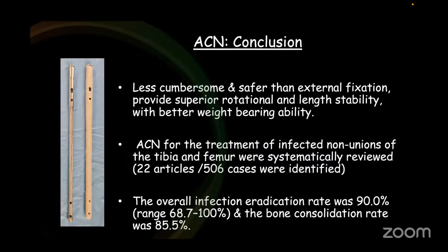Antibiotic coated nails for the treatment of infected non-unions of tibia and femur were systematically reviewed. 22 articles, 506 cases were identified, and the overall infection eradication was almost 90%. It ranged from 68 to 100%, and the bone consolidation rate was almost 86%.